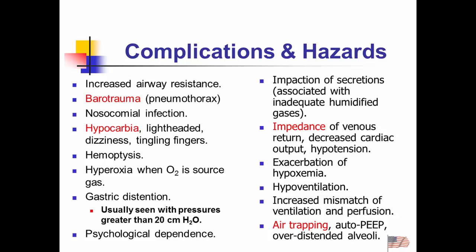Now, this slide I wanted to put a star by because you're going to come back and revisit this over the summer. Positive pressure ventilation, regardless if we're talking IPPB or mechanical ventilation or non-invasive, all have these similar complications and hazards. First of all, they can promote barotrauma in patients who have weak lungs. Somebody who's got a bleb or a bullae, higher risk of that positive pressure blowing that. I think you have a case study on something about a pneumothorax.